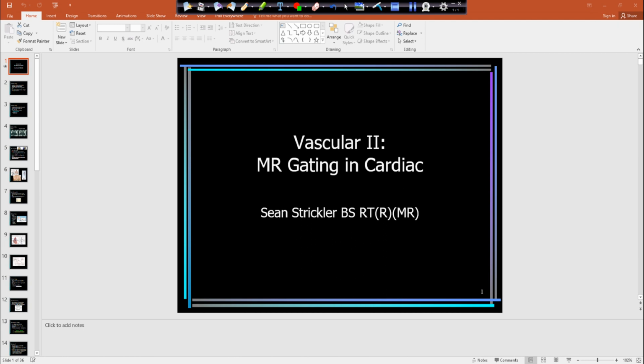All right, so today we're going to be going over MR gating in cardiac. I switched it up. Usually I cover vascular, but we're actually going to be using the next two lectures on vascular. It's a little harder concept to learn than cardiac gating. And cardiac gating kind of goes hand in hand with our artifacts lecture we went over last week, where we were talking about phase mismapping and motion artifacts. Gating, along with respiratory compensation, are ways that we can compensate for that particular artifact.